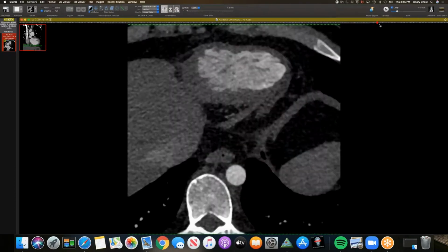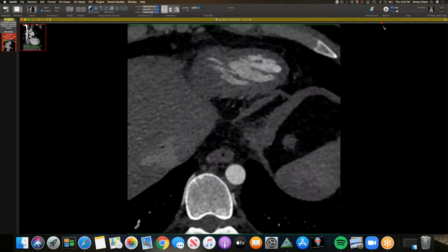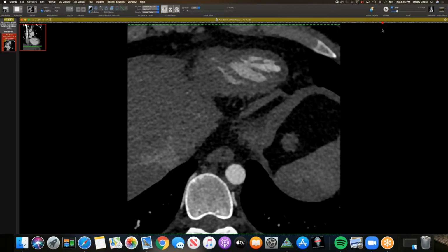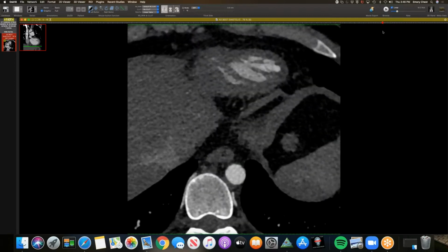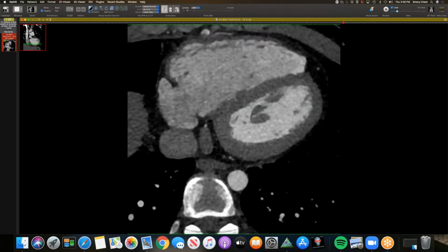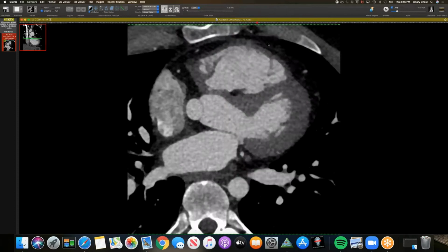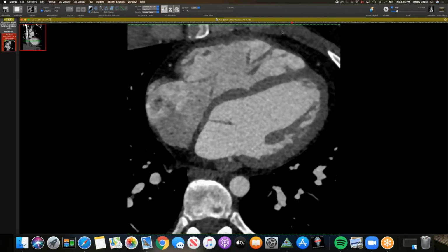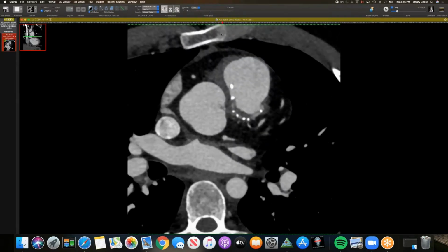Where is it draining? Is there an accessory drainage for the inferior interventricular vein? Follow that down. Where does that drain? I have cases where you have severe stenosis of the coronary sinus after intervention. If there wasn't drainage via either that other vein or this vein, there would be a lot of issues. The coronary sinus would be absolutely massive. So it has to have some accessory collateral pathway of drainage. I couldn't see anything else draining into the RA. Yeah, I was thinking the same thing. It might drain into that vertical vein, then into the brachiocephalic, and then the SVC. That's the only other pathway. But it's interesting.